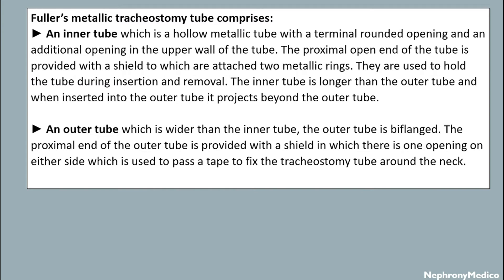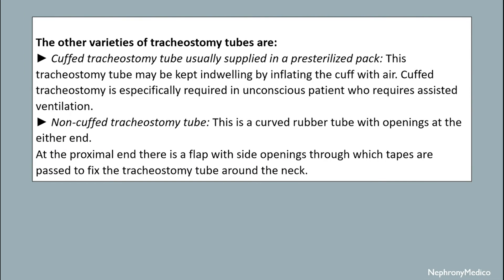When inserted into the outer tube, the inner tube projects beyond the outer tube. The outer tube is wider than the inner tube. The proximal end of the outer tube is provided with a shield in which there is one opening on either side, which is used to pass a tape to fix the tracheostomy tube around the neck.